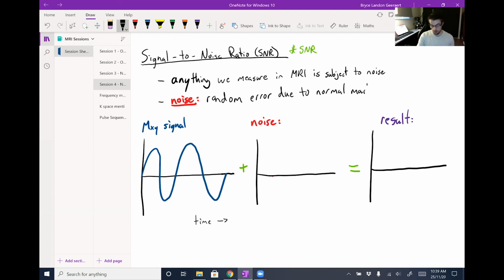The machine I'm talking about in this case is the MRI, but of course noise is present for any digital recording method. And rather than being a smooth, predictable signal that we're interested in, it just looks like small variations determined basically by chance.